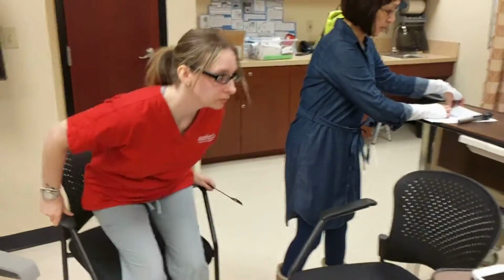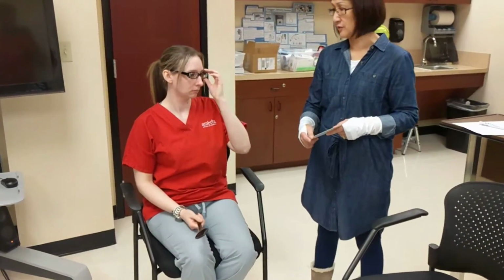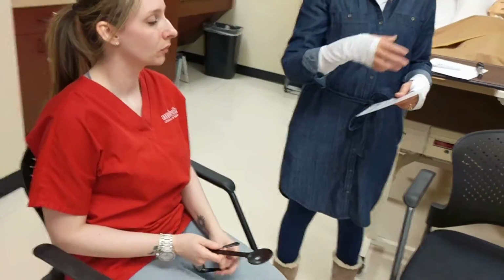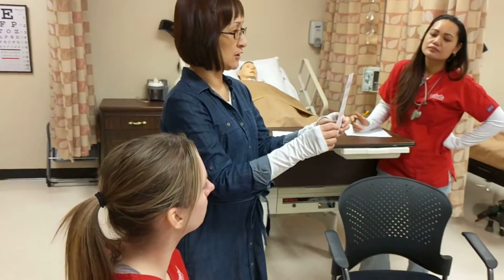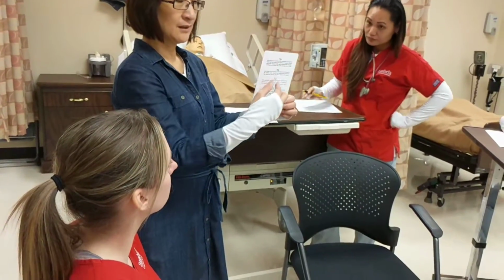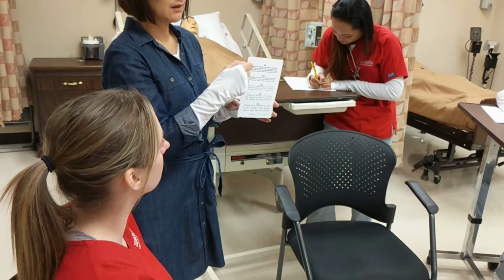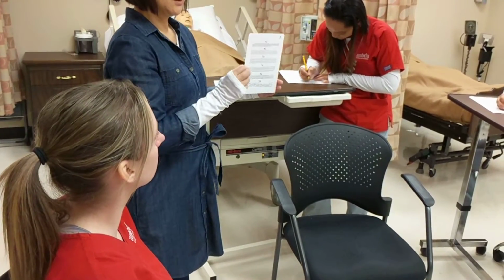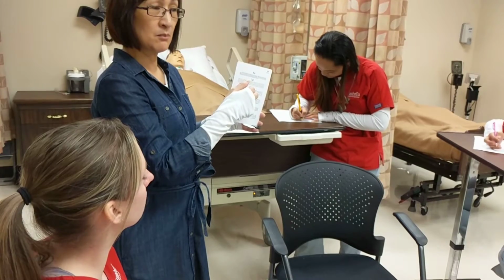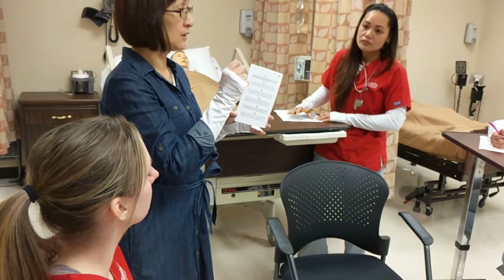So we now assess for near vision. So again, we assess one eye at a time. Glasses off. Okay. Now you will note, if you remember the Jaeger chart, the side that has the bigger font, you show it to them. If they can read the top box, then that's the time you flip it and ask them which box number can they read, the smallest box number they can read. Just ask them to read the first line.